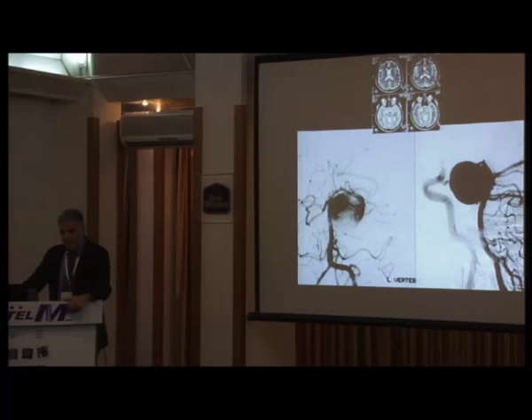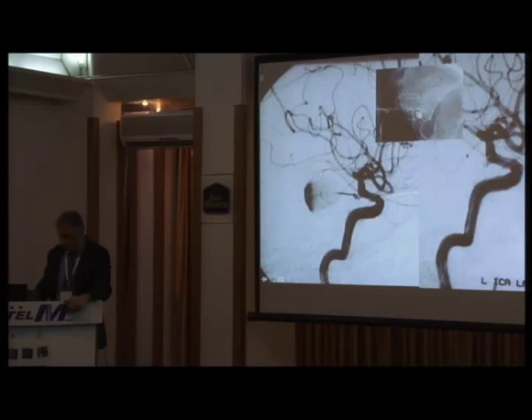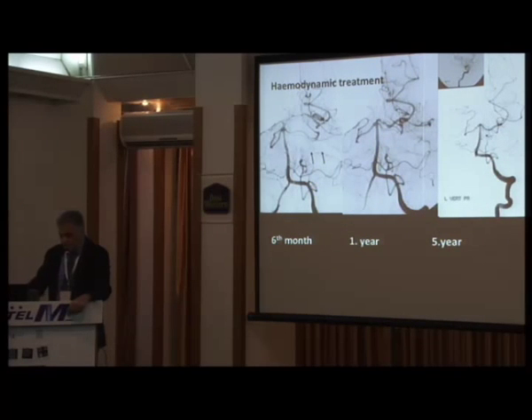This is one of the cases where I realized it, an isolated posterior communicating artery aneurysm. The patient came to me with a thalamic infarction. It's easy to coil it by sacrificing the posterior cerebral artery. But at that time, I used the coronary stent on the P1 and P2 junction. Look at the flow, how dramatic the change is, and then a coil in the orifice of the posterior communicating artery, no coil at all in the sac. So what happened? In 6 months, intimal hyperplasia in the stent, the aneurysm is still there but thrombosed. In 1 year, the aneurysm starts to shrink and the intimal hyperplasia reduces. This is the 5 year. Everything turned back to normal by using hemodynamics.